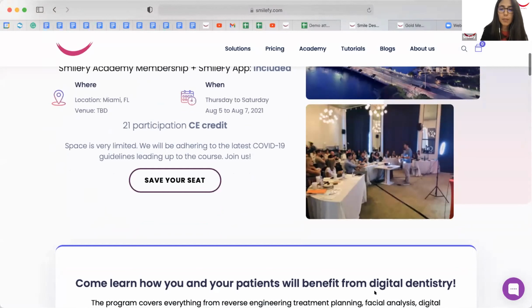Okay, let me see if there are questions right here. Thank you. Okay. The name of the printer, will you send that? Yes, I will send you the exact printer model for the next one. Because I do have it, I just don't have it at the moment, but I'm going to send it to you, Dr. Jeanette.